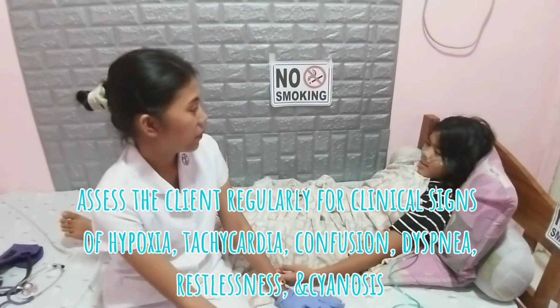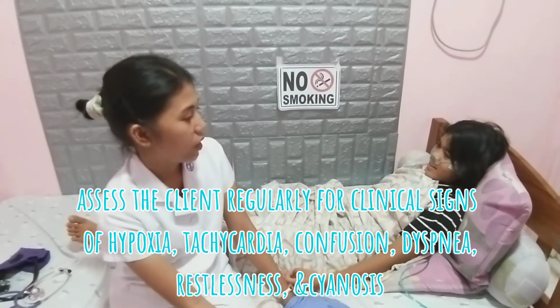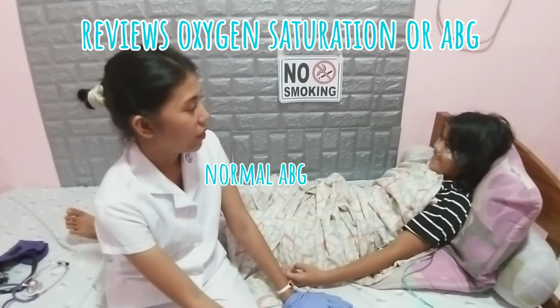Assess the client in 15 to 30 minutes depending on the client's condition. Observe the patient with her breathing and comfortability.